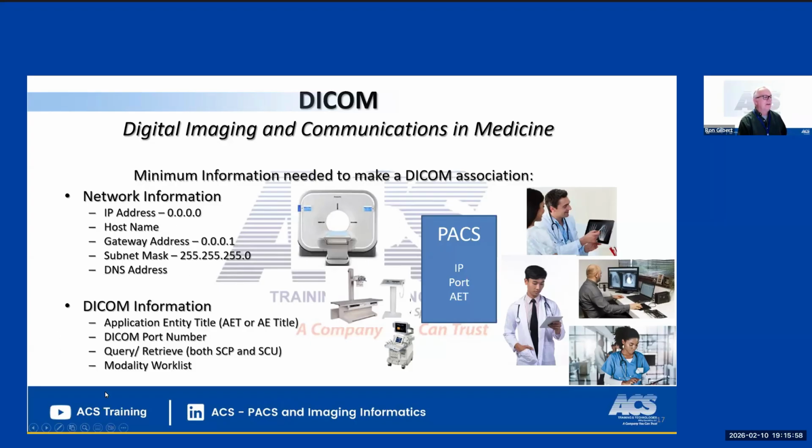Then you're going to program the DICOM information so that it can share with other DICOM devices, either on site or off site, or maybe sending DICOM information to another hospital where that patient went a year from now, or maybe a year ago. And that is how the new world goes. So this is the big standard.